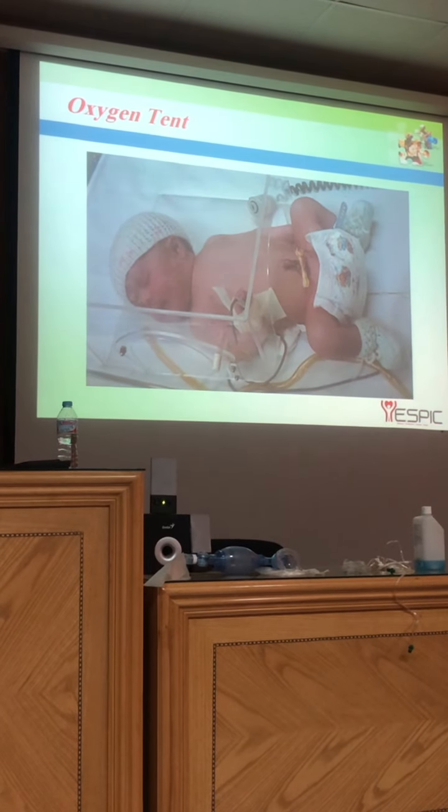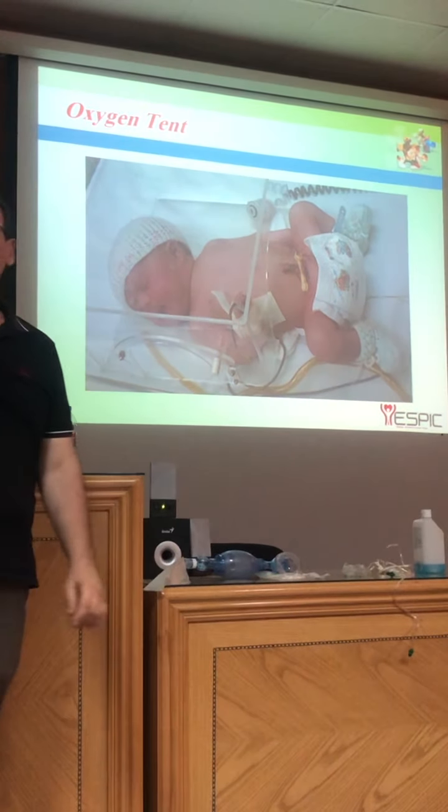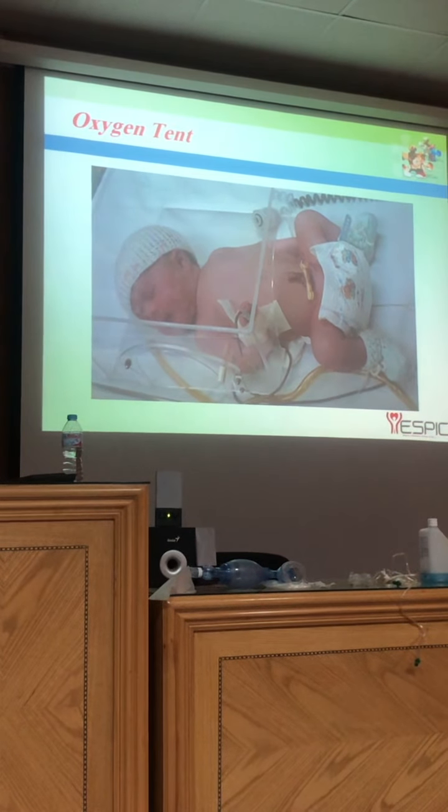The oxygen tent or the head box is the preferred method for pneumonia and lung problems because it gives 100% oxygen.